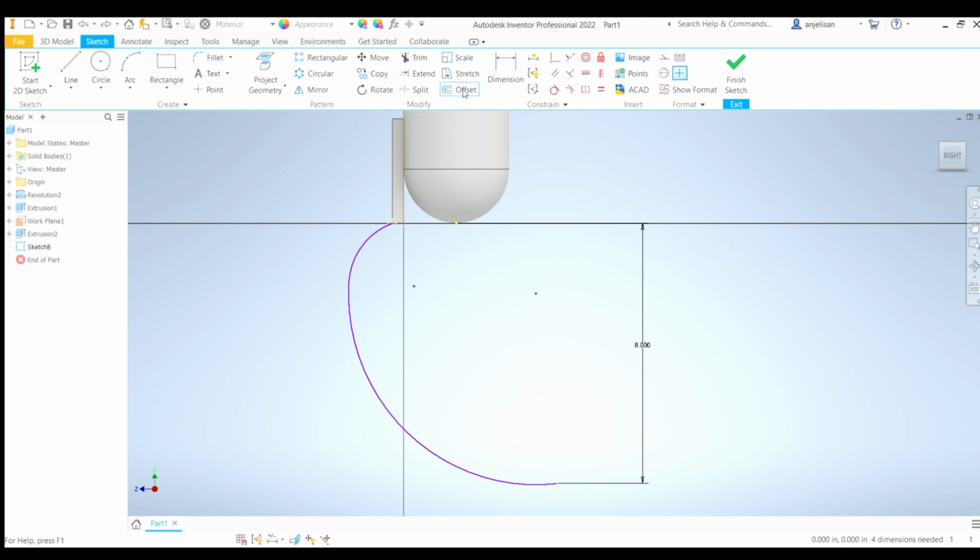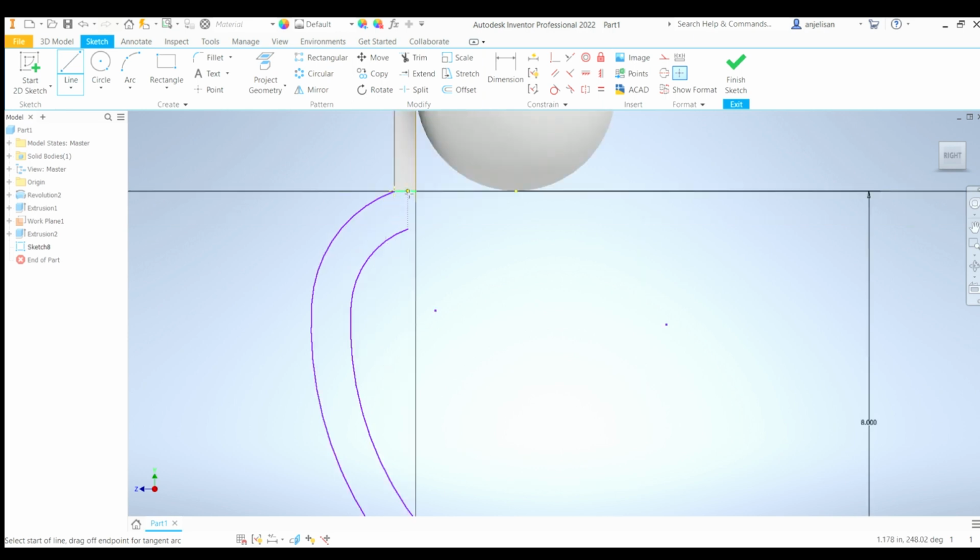Okay, so now we can just offset this arc, and what this allows us to do is duplicate it and move it. Let's say I'm not too concerned about the thickness. Let's say we want 0.65 inches of thickness. So now we have a pretty thick arc, and then we can go to the line tool. We can select this inner corner of the rectangle, and just close this part off.